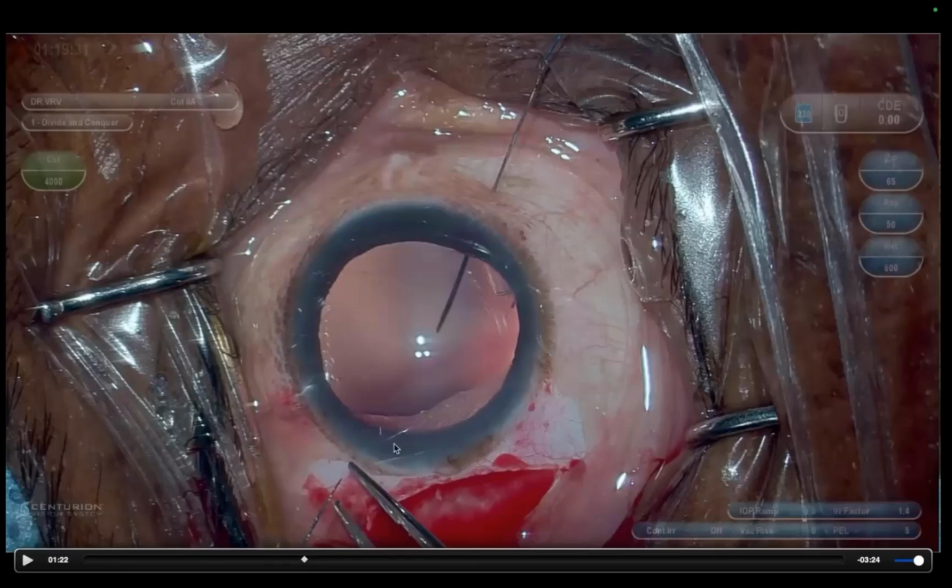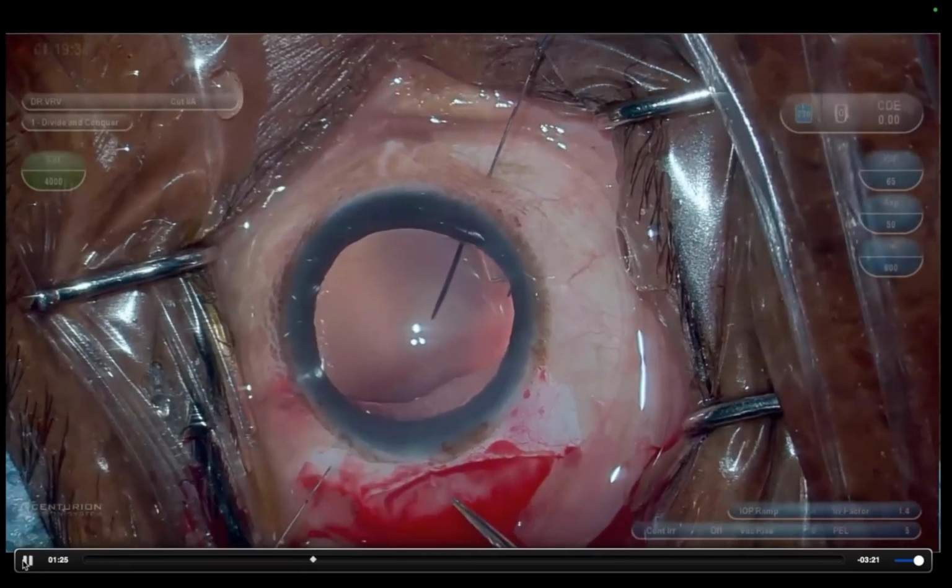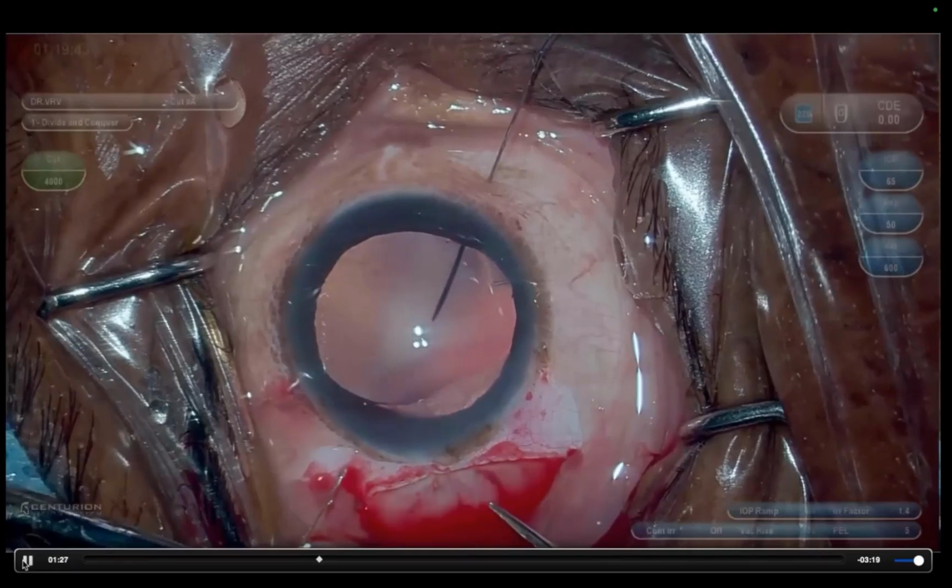So I'll do a larger peritomy because at the end of surgery, when you're flanging, you want to keep that area dry. You don't want to burn the conjunctiva off. So first sclerotomy is done, and the second sclerotomy exactly 6 clock hours away, you do a sclerotomy.